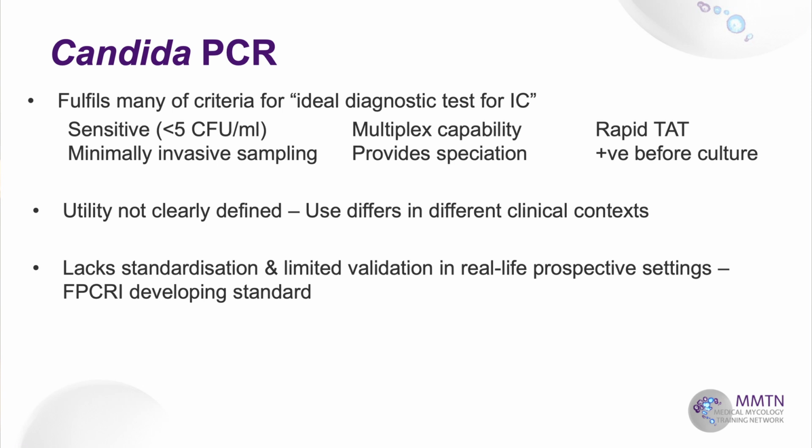But at this stage, utility is still not really clearly defined, and the use of Candida PCR does differ in different clinical contexts. At this stage, Candida PCR does lack standardisation, and there's limited validation in real-life prospective settings. So the Fungal PCR Initiative group are working towards developing a standardisation for performing PCR.